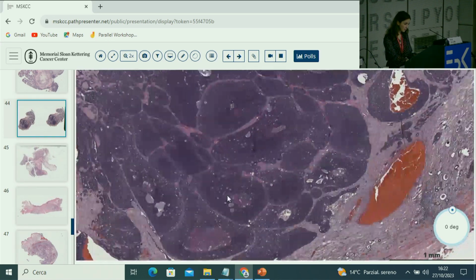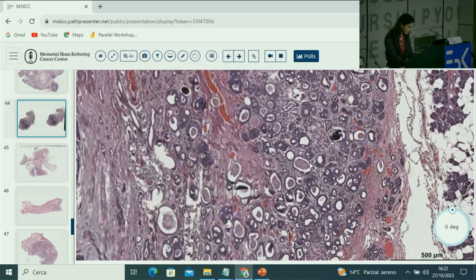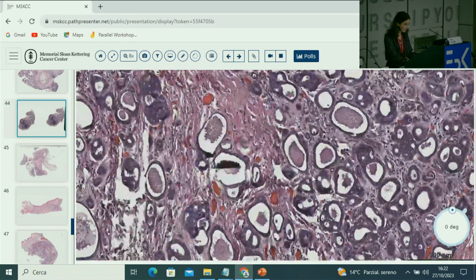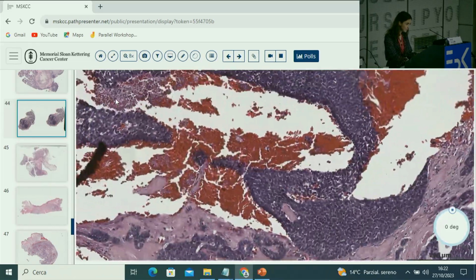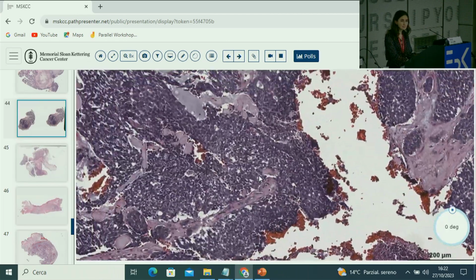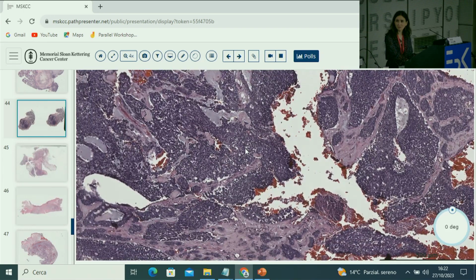And actually, if we look around, that's why it's always helpful to look at everything. We see a more conventional, let's say, adenoid cystic with tubular formation. But if we only have this, sometimes it's hard, especially we see these sometimes in sinonasal area, where the differential can be broad, can include a non-intestinal type, high grade sinonasal carcinoma, can include neuroendocrine carcinoma. So do a lot of stains in these cases.